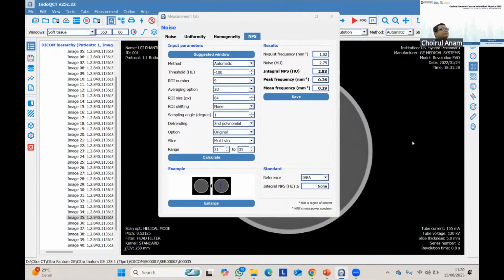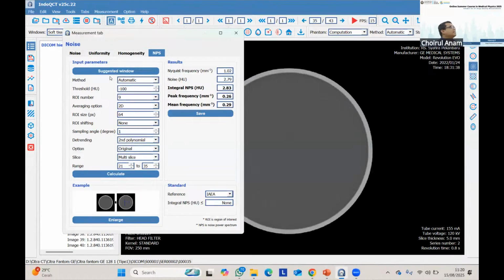Yeah, enough. Okay, we move to the question from the YouTube channel, from Physics QIA. What is the difference between threshold and limit in the homogeneity subparameter? Yeah, sorry. This one, the threshold is for automatic detection of the phantom.